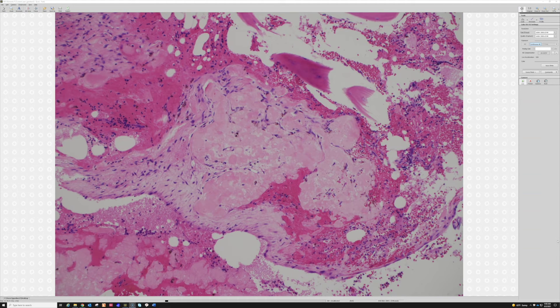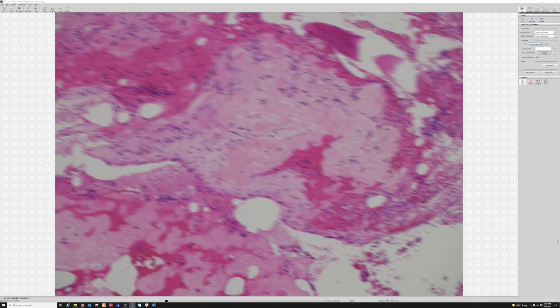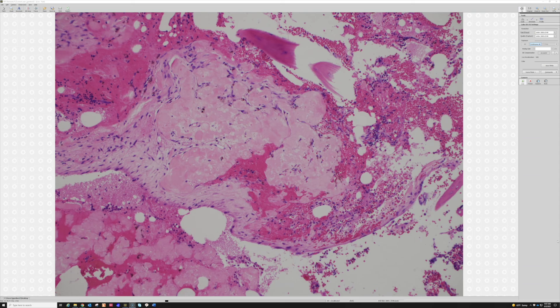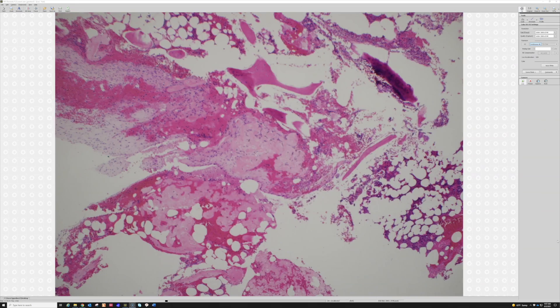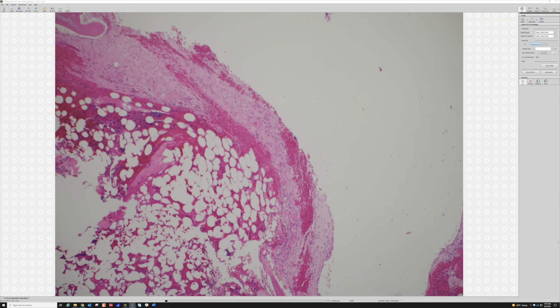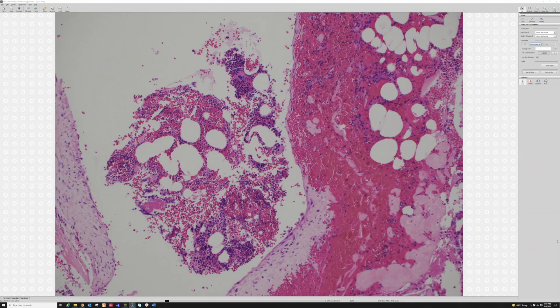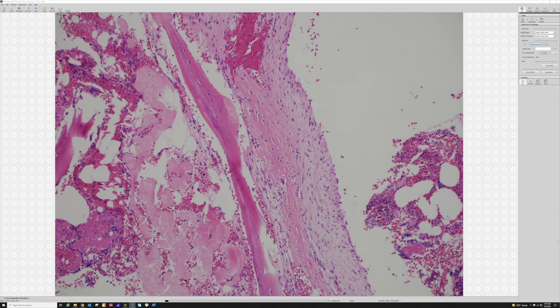Here's another look at that homogenized fibrinoid stuff. Sometimes it can form concentric lamellated spherical structures that become calcified, and some people have likened it to the cementum-like material seen in bone lesions of the jaw. I find oral pathology bone lesions to be a whole complicated world apart — very challenging and complex. In any case, this material sometimes can begin to mimic cementum, as some people have said. So: thin fibrous lining, that homogenized pink material, sometimes hemosiderin, sometimes a few giant cells — put that together with the radiographic information and you have a solitary bone cyst, also known as a simple bone cyst or unicameral bone cyst, which is benign.